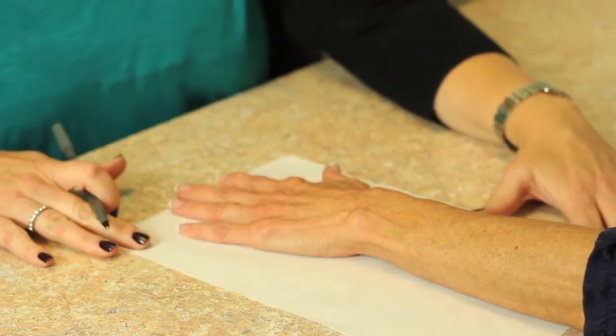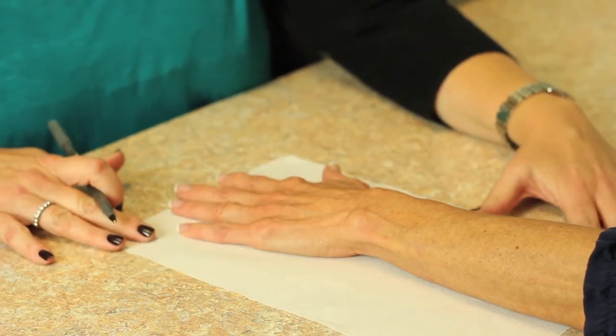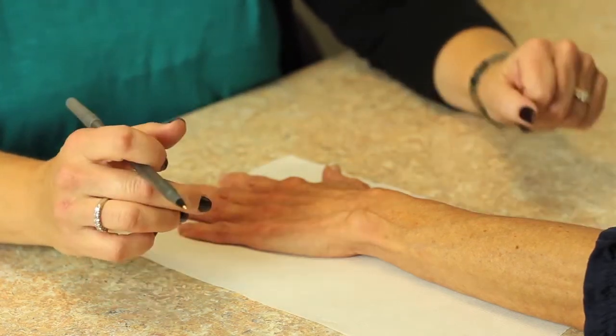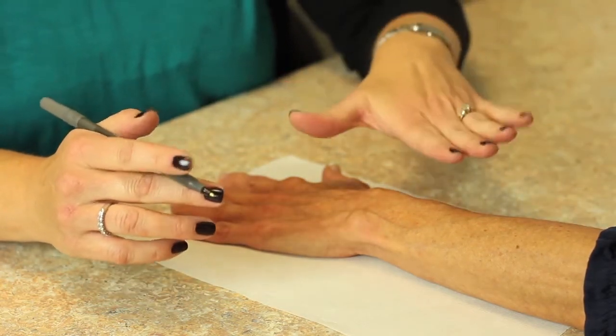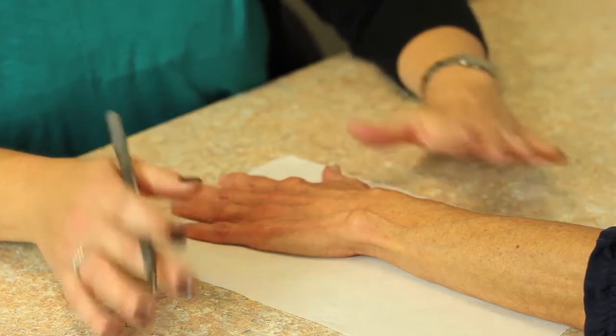Just make sure you have a paper towel that's long enough to include the forearm and the hand within the design. What we're going to do first is lay that hand down and usually the hand is going to rest in just slight ulnar deviation which is normal for them.